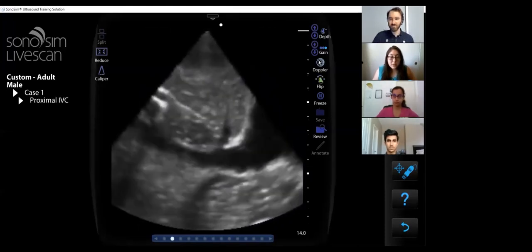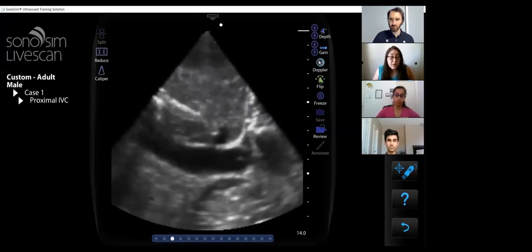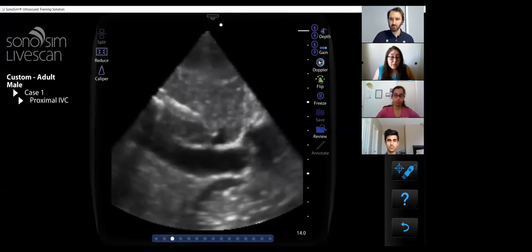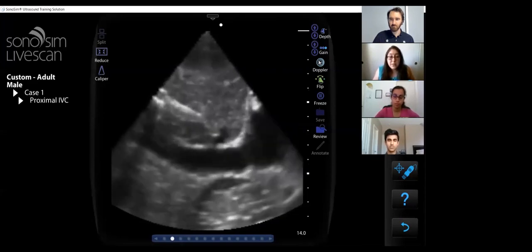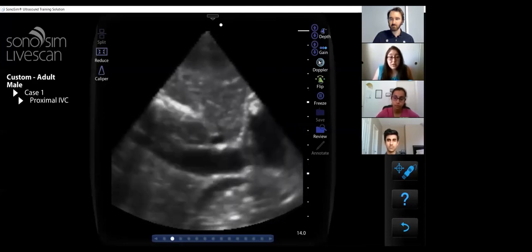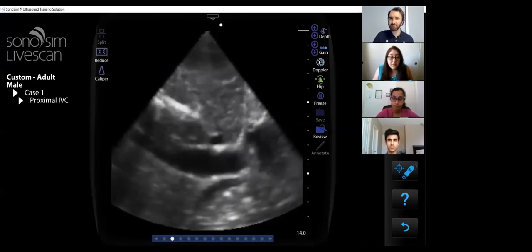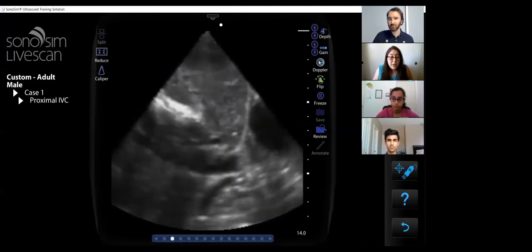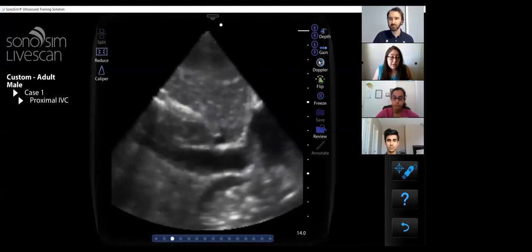Okay, so based on what you've seen, what are you thinking that this might be? Well, in the context of an elderly nursing home patient who's presenting with fevers and cough, it could be consistent with diffuse alveolar interstitial syndrome, which could also be suggestive of widespread involvement of both lungs due to COVID-19 infection. Alternatively, another viral pneumonia could be the explanation. Okay, and what makes you think it's not pulmonary fibrosis, CHF? It could be, but based on the clinical context and the normal limited echo findings, it's less supportive of those etiologies.